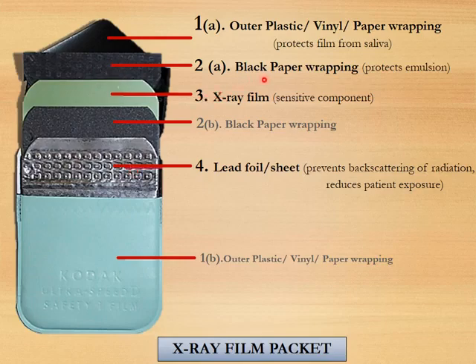The second component is the black paper wrapping, which is also on two sides of the packet. The third component is the x-ray film, and the fourth component is the lead foil or sheet. The function of the plastic, vinyl, or paper wrapping is to protect the film from saliva.